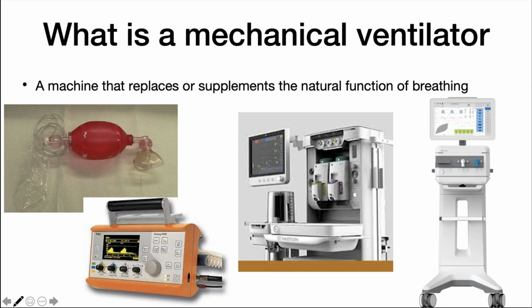Mechanical ventilation is not intended to normalise gas exchange, nor is it a cure. The goals are to maintain sufficient oxygenation and ventilation to ensure tissue viability until the disease process that has compromised the patient's lung function has resolved, while minimising any complications. Thus, PaO2, PaCO2 and pH levels are maintained in ranges that provide a safe environment for the patient, while protecting the lungs from damage caused by oxygen toxicity, pressure or barotrauma, tidal volume over distension or volutrauma, atelectrauma, and cytokine release or biotrauma.